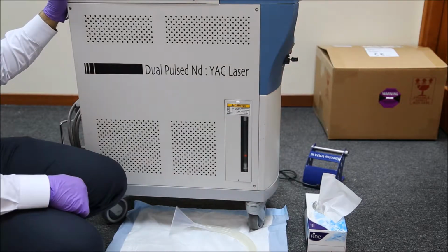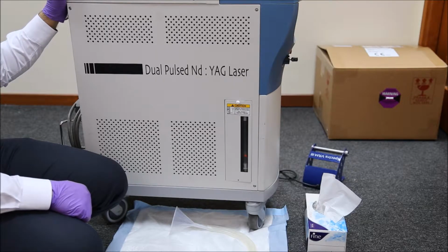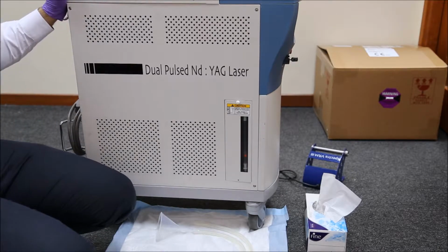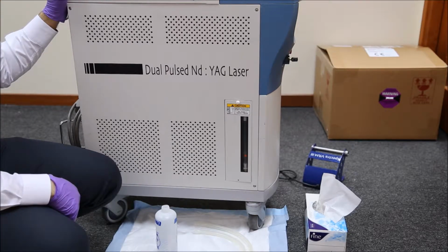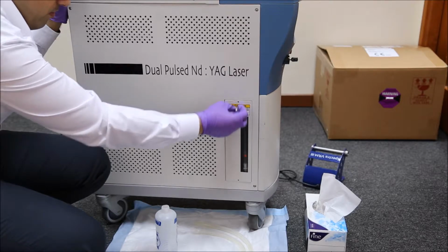distilled water. Second, how to refill cooling water. 1. Ready the funnel, tube provided, and fresh distilled water for use. 2. Take off the water level window by unscrewing the upper bolt and the lower bolt with your hands.